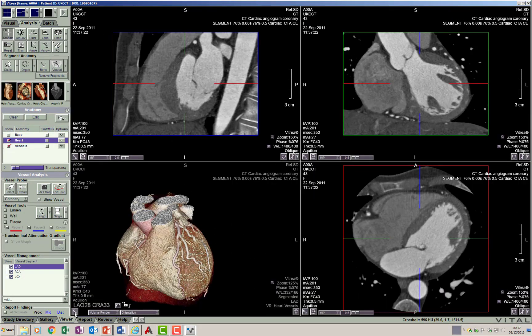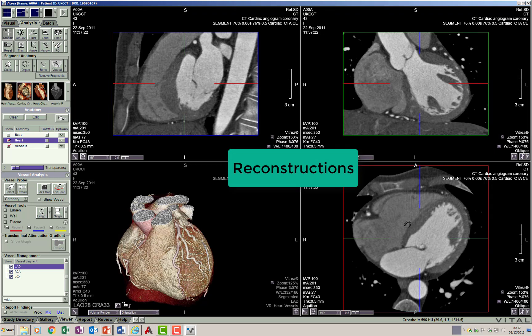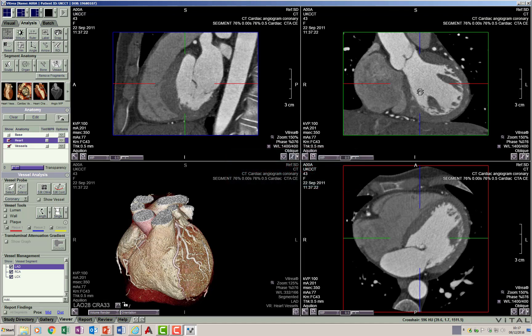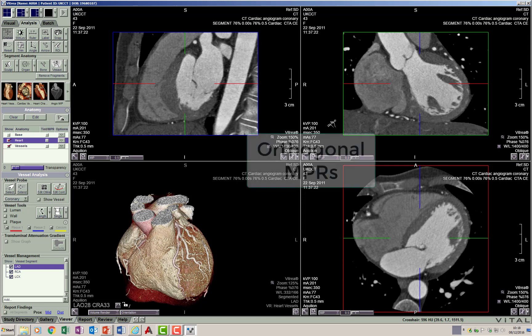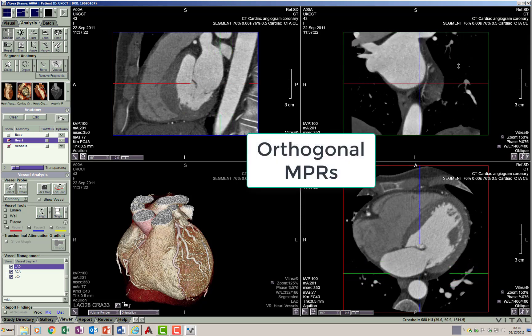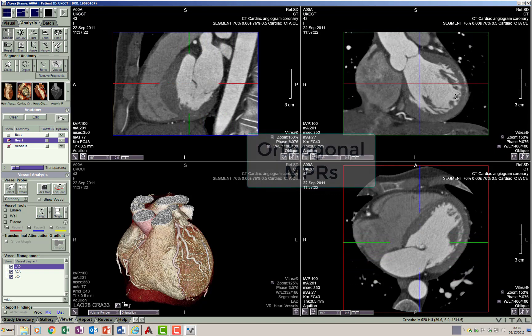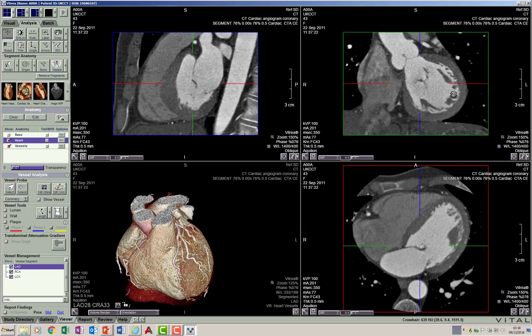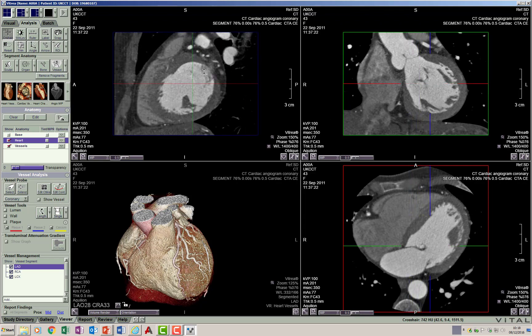Let's go back to the software to understand the different kinds of reconstructions available on CT. Images are acquired in the axial plane and then displayed in coronal and sagittal planes — these are called multiplanar reconstructions, or simply MPRs. Because the coronal and sagittal planes are perpendicular to each other, they are also referred to as orthogonal MPRs. Software like this allows images to be displayed in different planes and scrolled through.